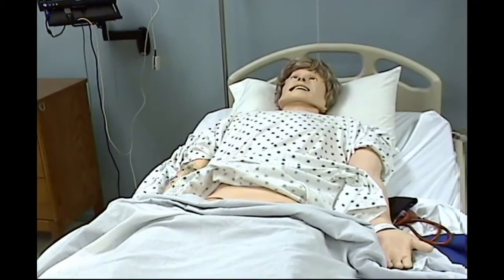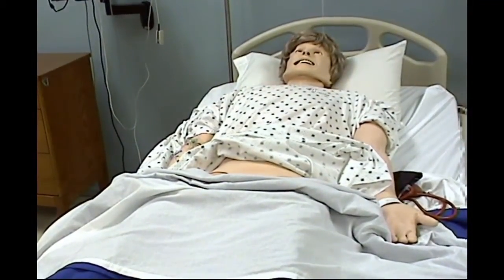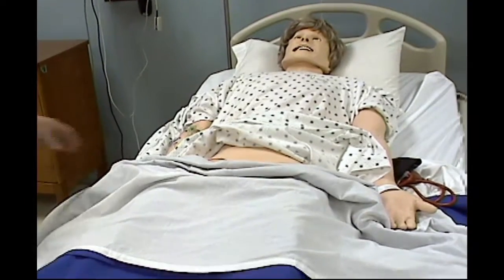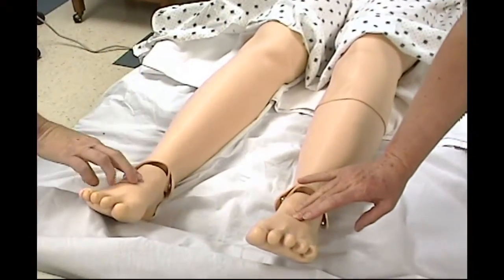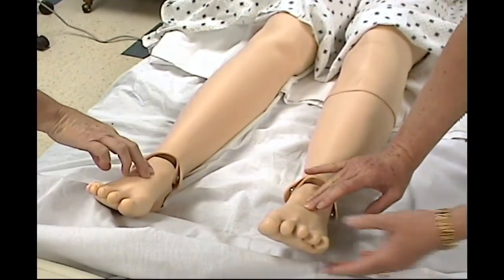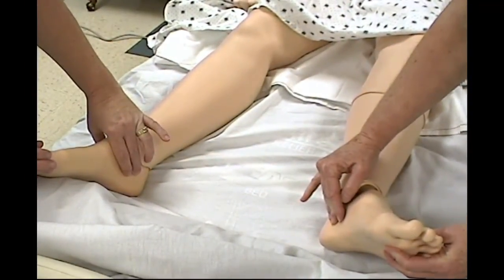A urinary catheter may be inserted and urinary return can be obtained when the catheter is properly placed. Simulator may have either male or female genitalia based on the simulation that you are being asked to run. Bilateral pedal pulses and posterior tibial pulses are palpable as well. The soft spot is located in the middle of the foot. Press down and back off, and the posterior tibial is present in the lower inner aspect.